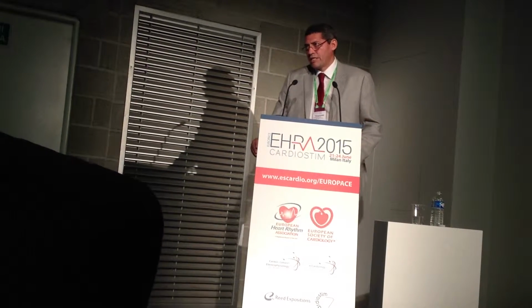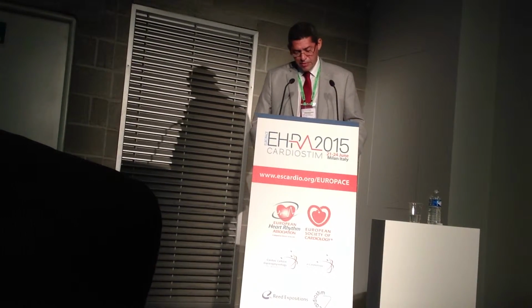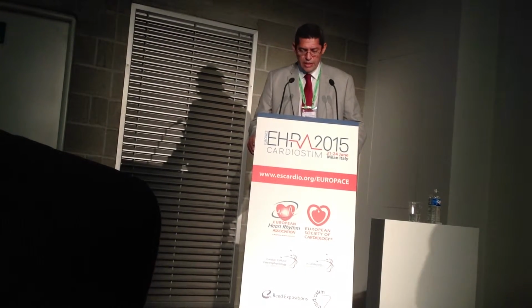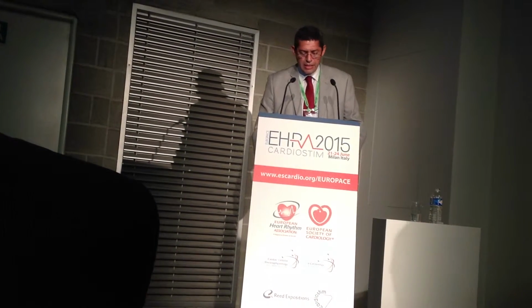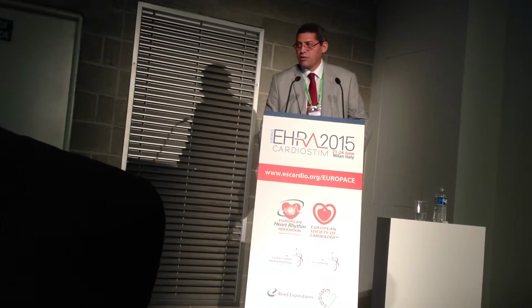Some maneuvers can be useful to differentiate right origin from left origin. This is frequently a challenge too. As you can see here, in the case of unsuccessful ablation in the right ventricle, the catheter can be used for mapping the opposite side, as in this case, with unsuccessful ablation in the RVOT, but with successful ablation in the right coronary cusp.